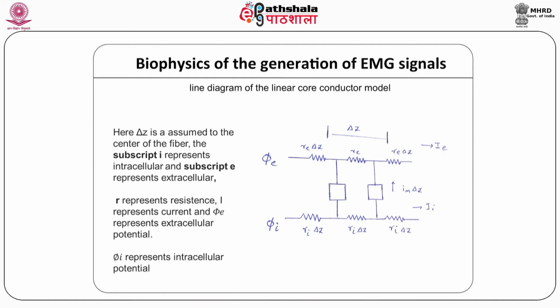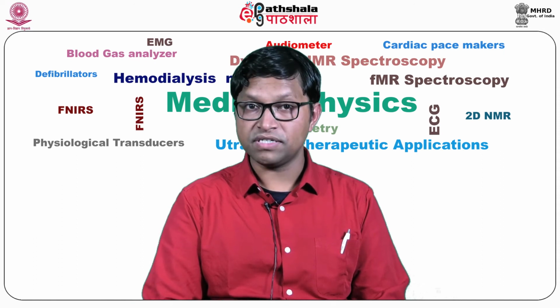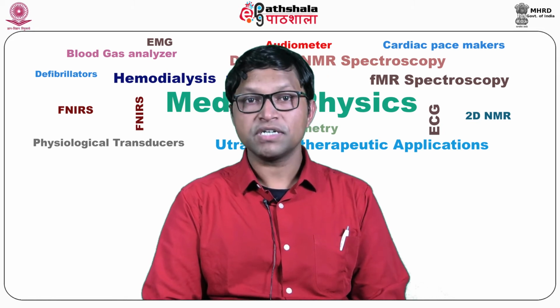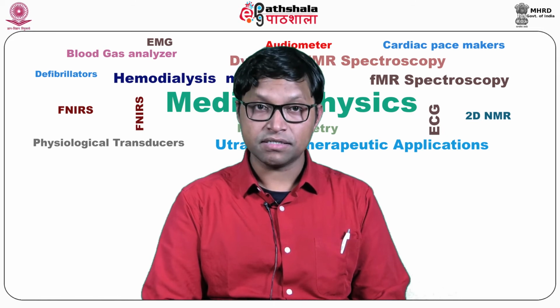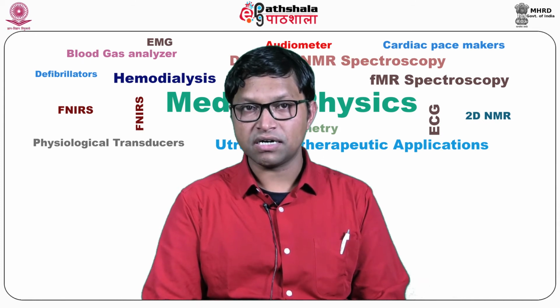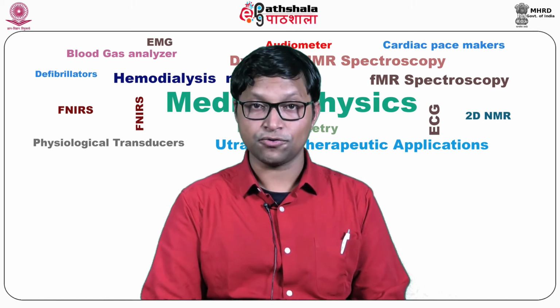the tendon endings. We know that a current flow is also associated with potential changes. This propagating action potential creates a transmembrane current profile that also travels along the membrane of the muscle, or sarcolemma. For the muscle fibers, the lengths of the depolarization and repolarization are very small, in the order of millimeters. So, we can consider a muscle fiber a very thin tube in which the current flows only axially. In other words, it can be considered as a line source model.